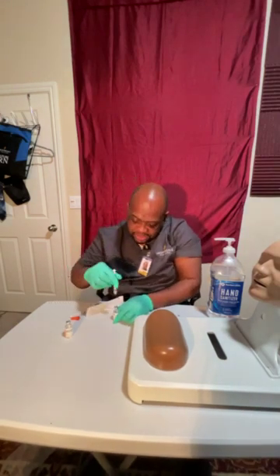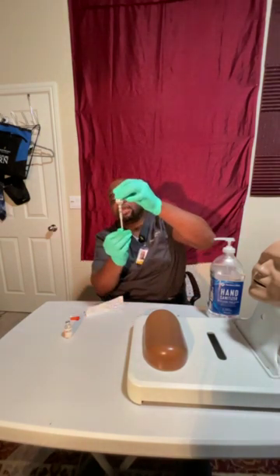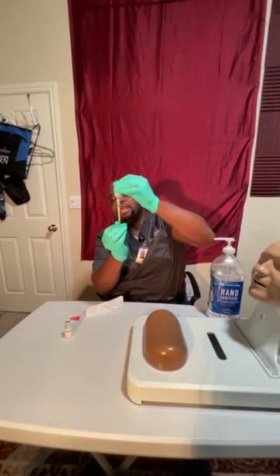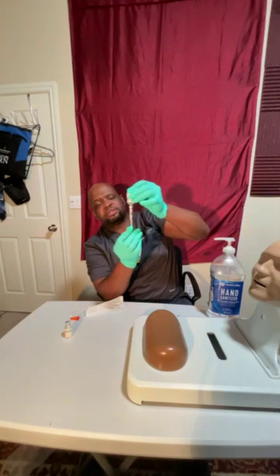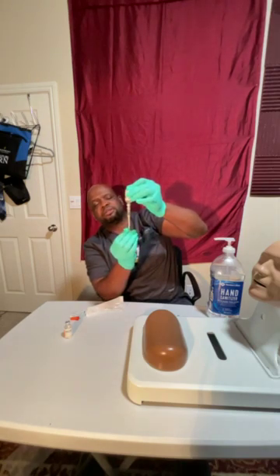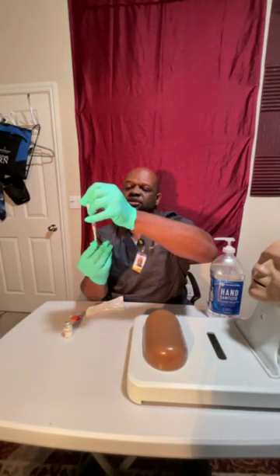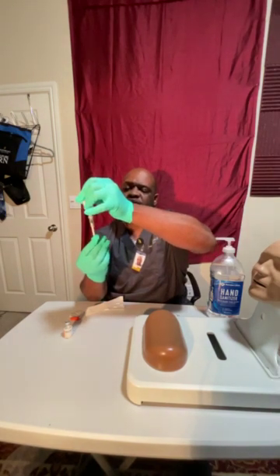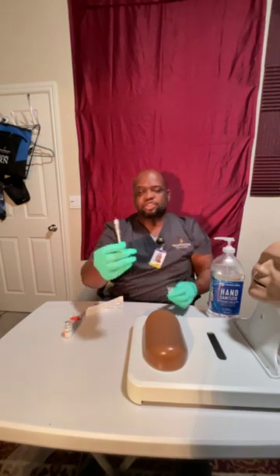And then from there, we want to go to the NPH. We want to gently put the syringe in here. Gently put it in. Now we want to invert the bottle. And now we want to pull out 8 units, making it a total of 12 units. All right, 12 units. Right, good. And making sure we don't press on the plunger at all. Good, there's a 10 and 12. Good, so we got that.